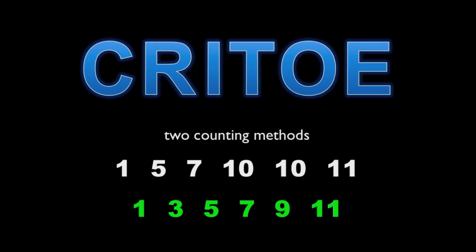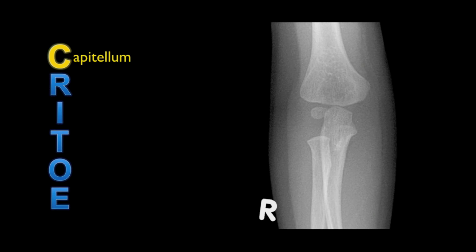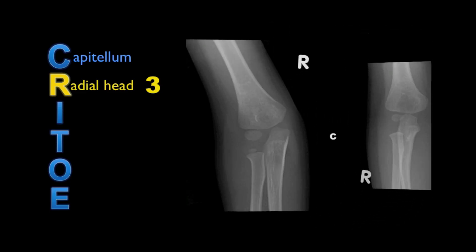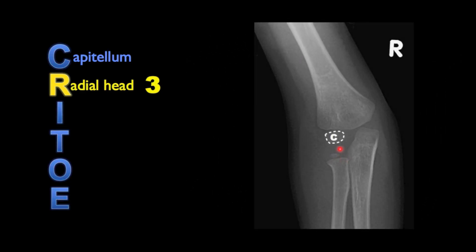So let's take a look at what each of the letters in CRITOE stand for. C is for capitellum, which is the first ossification centre to appear at around age 1. You can see it here in this child. The second ossification centre to appear, R, is for radial head, appearing at around age 3. This child has not yet developed a radial head, but if we switch to a slightly older child we can see a radial head ossification centre developing in its normal location.